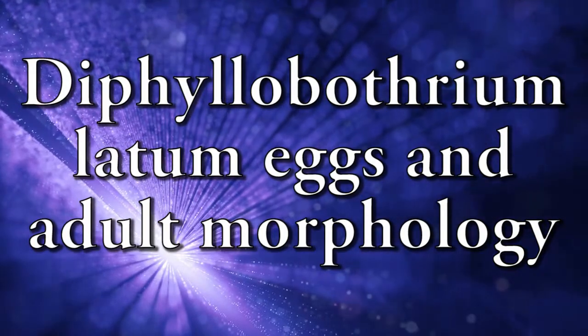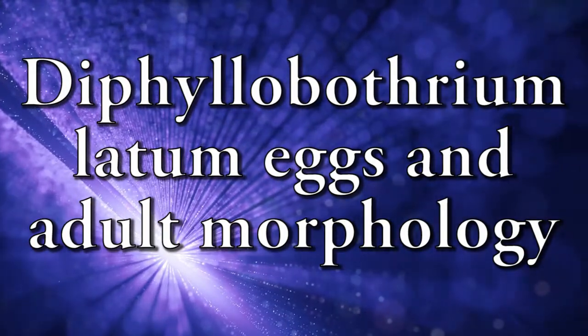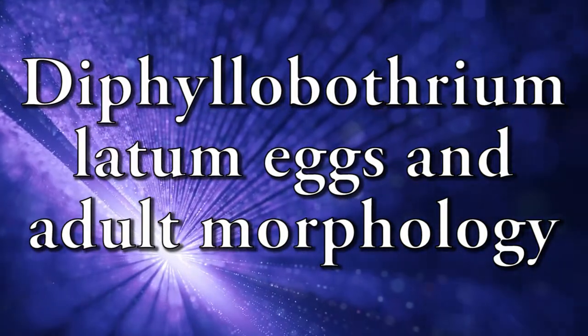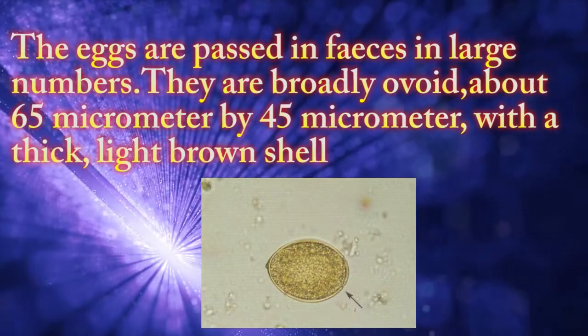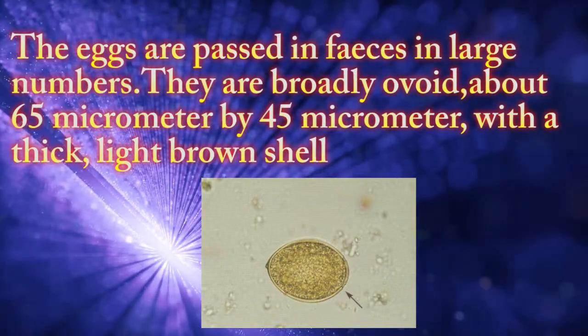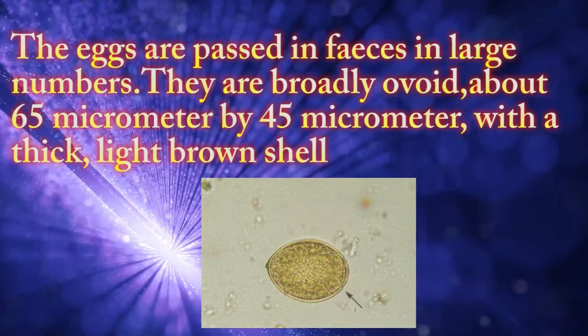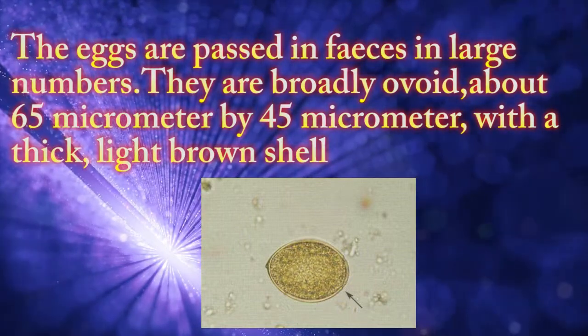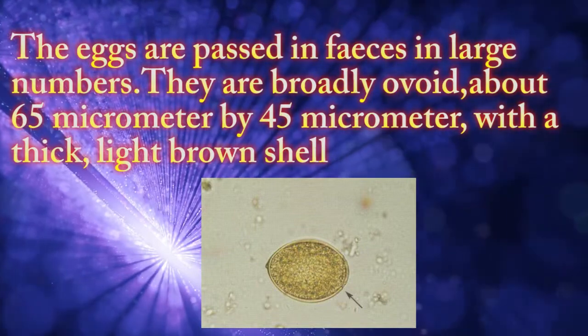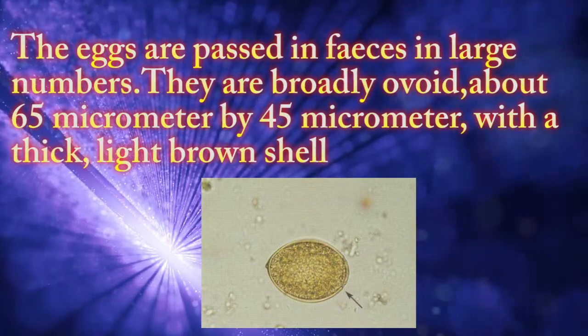This video is about Diphyllobothrium latum. The eggs are passed in feces in large numbers. They are broadly oval, about 65 micrometers by 45 micrometers, with a thick, light brown shell.